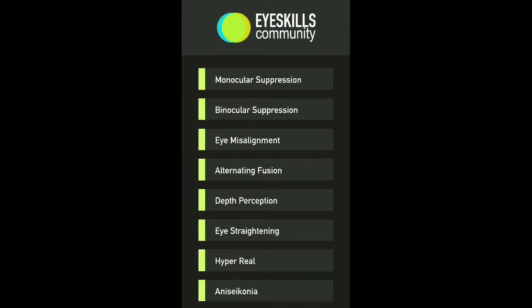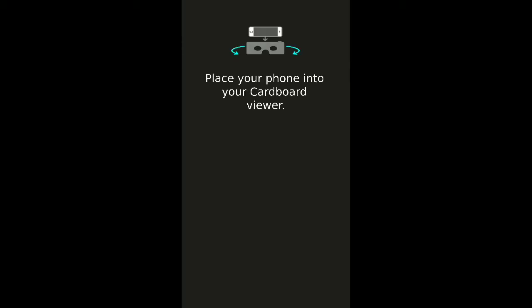So if we go back out by hitting Q, we can take a look at the binocular suppression scene. I think it's pretty clear how to use that already, but again, navigate down, press E, and as you look up or down, the relative luminance of the scene changes.